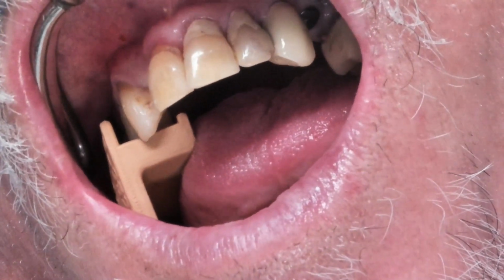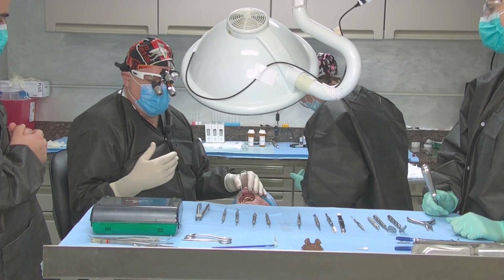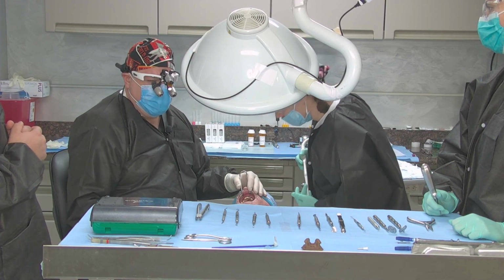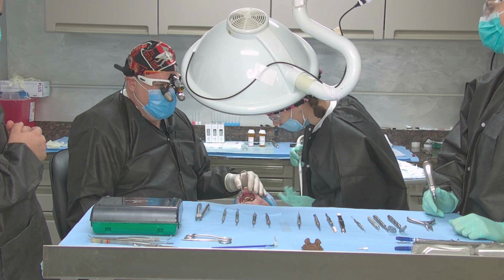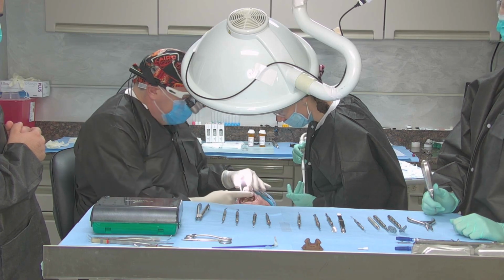So we'll be talking about the whole process of the system, how we deliver it to Alan today. Also, we're going to be doing some A-PRF bone grafting, and then, of course, converting the final provisional restoration.